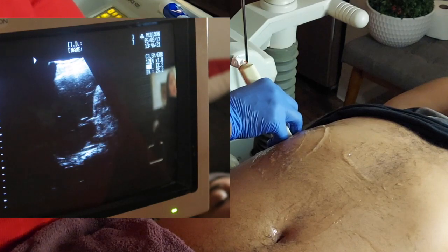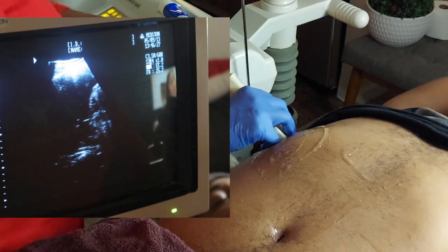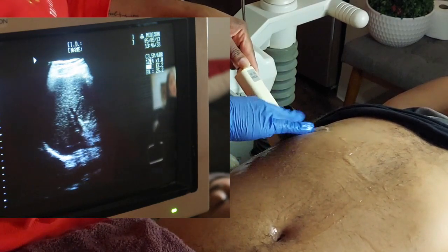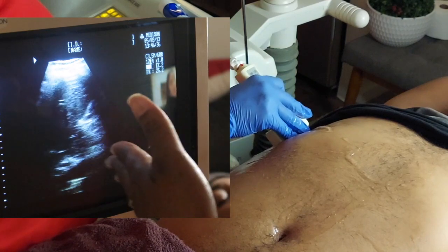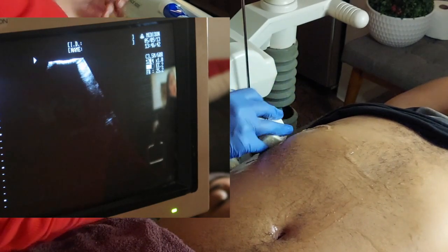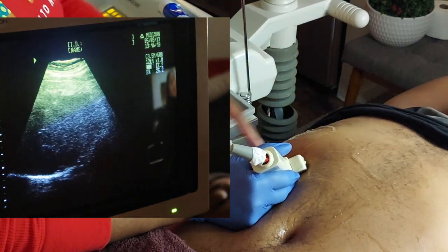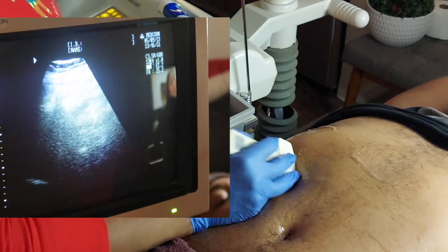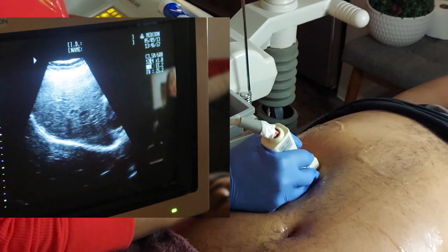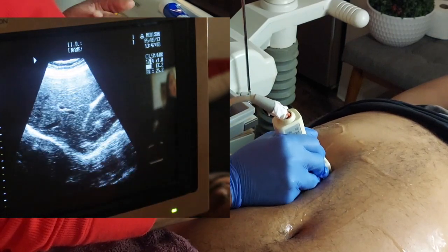We're going to pretend I'm going over a rib on purpose. So this is the image you're getting — I'm scanning the right upper quadrant, right over his ribs, and nine times out of ten I'm going to get rib shadowing. What I like to do is move my probe all the way down under the edge of the rib cage. Then I'm going to have the patient take a deep breath in and hold it. Now that I'm under there, I'm pushing really hard and firm, and I'm able to see the liver without any rib shadowing.